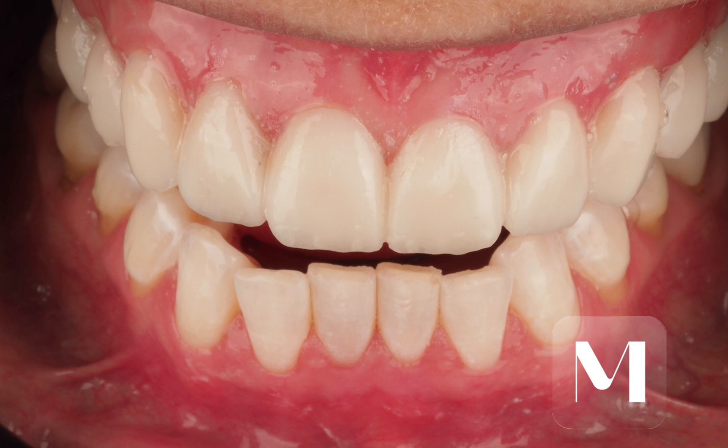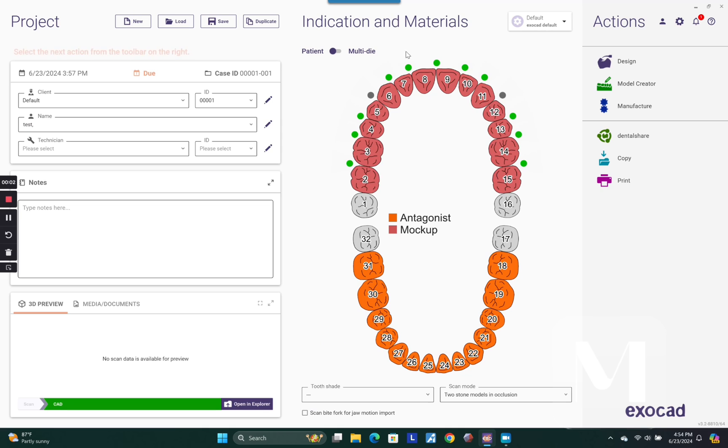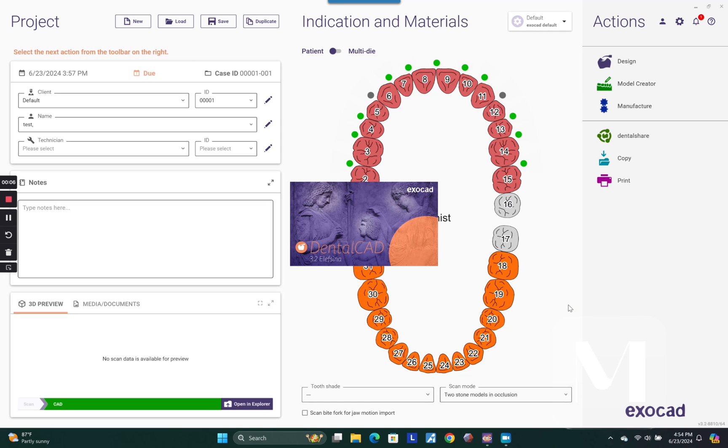So what you need to do is actually open up a case in which you do a diagnostic wax up. Make sure you're doing your diagnostic wax up in the mock-up module. This really helps because that is a very powerful Boolean tool.